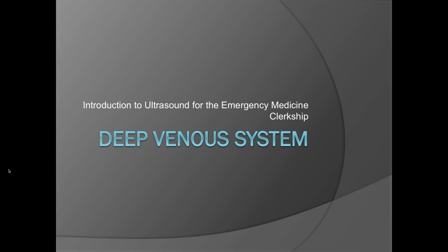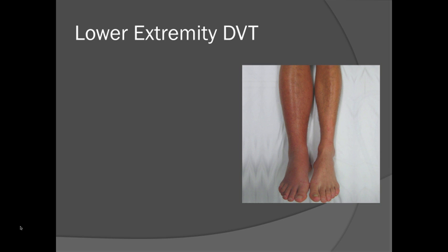Hi there, my name's Bob Furlong, and today we're going to be talking about the use of ultrasound in the evaluation of the deep venous system.